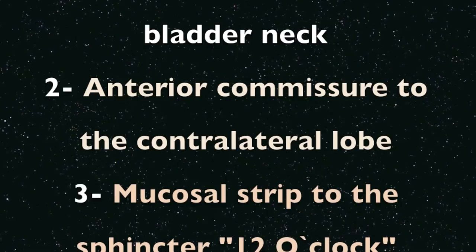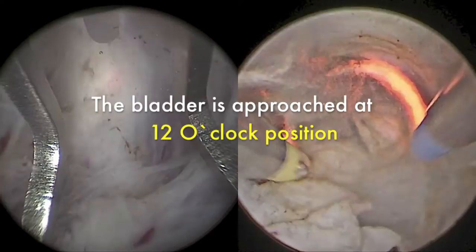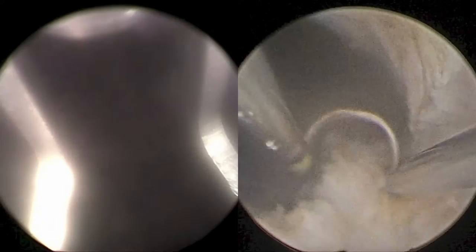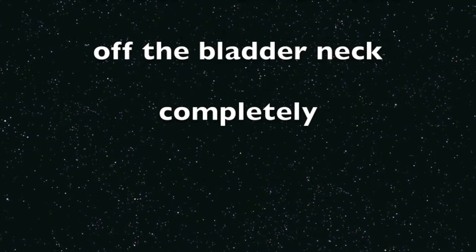In both procedures, at this stage the adenoma is still attached circumferentially at the bladder neck, with anterior compression to the contralateral lobe and a mucosal strip anchoring the adenoma to the sphincter at 12 o'clock position. Then the bladder neck is approached at the 12 o'clock position. In the HoLEP procedure, the adenoma is detached from the bladder neck completely and all around.